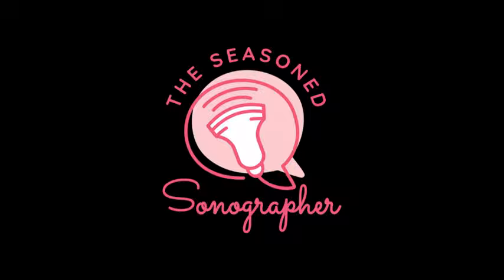At what point does Doppler abnormality become concerning enough to change the management? Yes, so we have different ranges for each gestational age. We use different tools such as perinatology.com, and we can put in their gestational age and it'll tell us where that 95th percentile is.